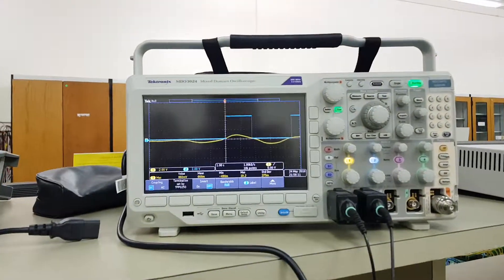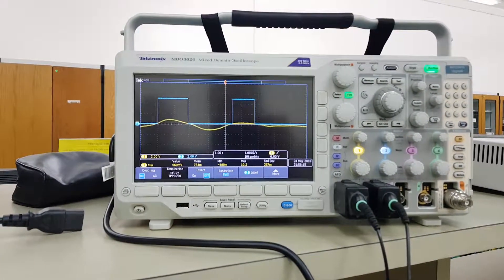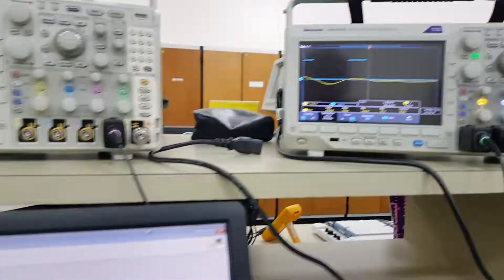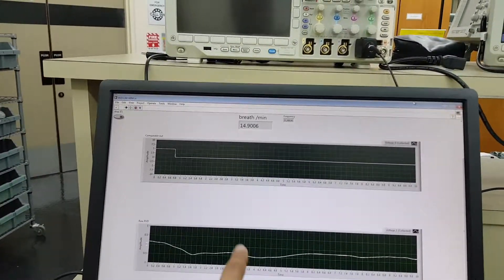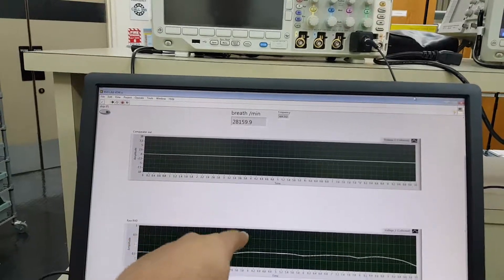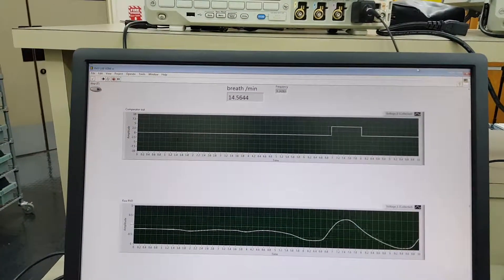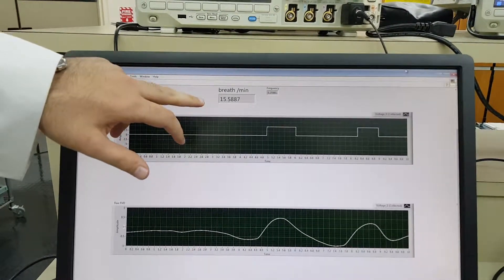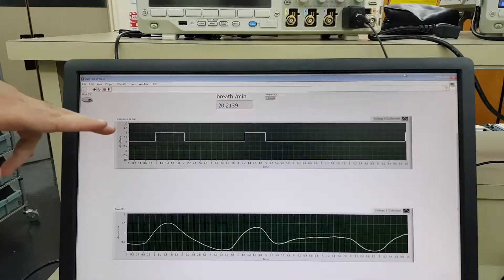It will also be shown on the oscilloscope. The display here shows how many breaths per minute. The reading is 14, and for adults the normal range is from 12 to 18 breaths per minute.